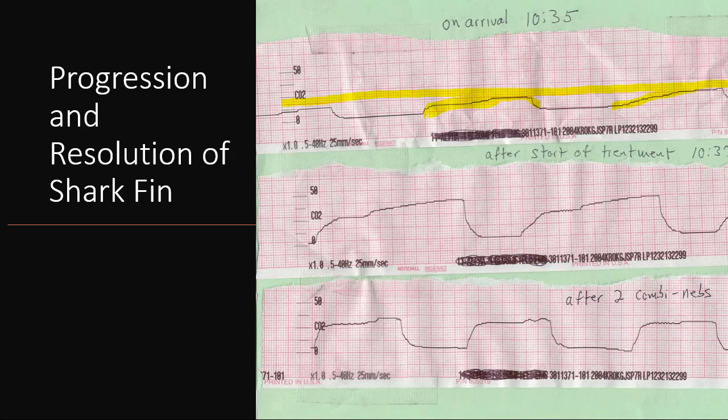And then here, after treatment, 3 minutes later, look at this. We still have shark fin, but look at how much more end-tidal CO2 is being released. I like that. And then here's your second one. So this is probably around, that's 25, that's above that. Here we are. Now we're still only about 30, but now we have a much better plateau, much better waveform. So I like that.